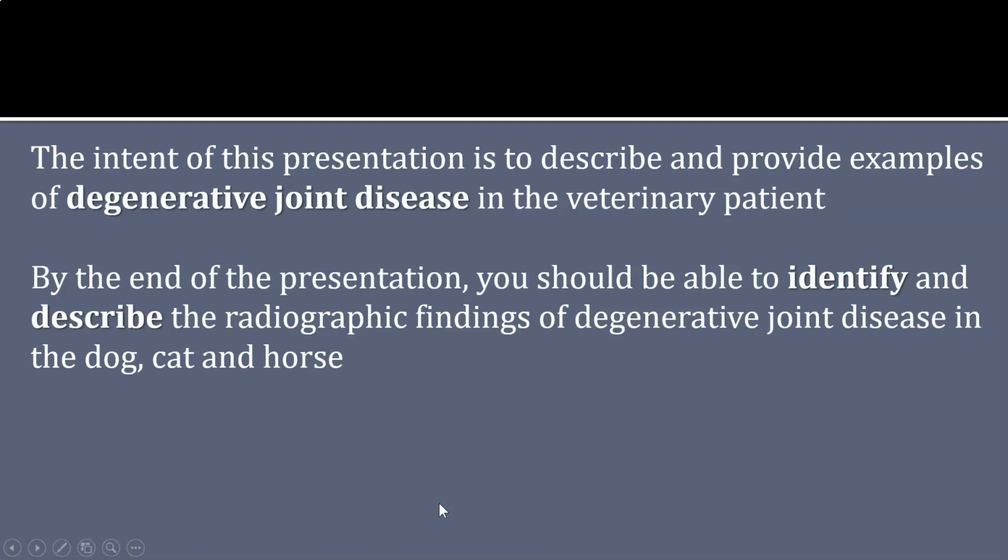There are many potential joint disorders you may encounter that can lead to degenerative joint disease, so starting with identifying this process on radiographs is truly relevant. The following lectures will focus on the underlying disorders that lead to these more chronic changes.